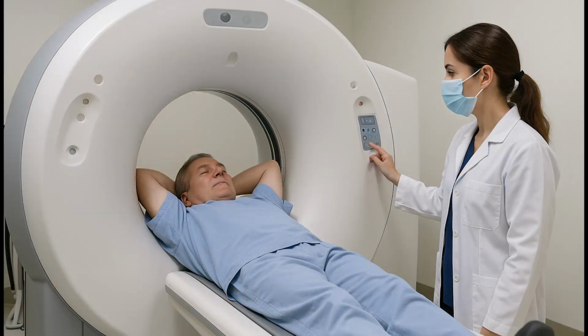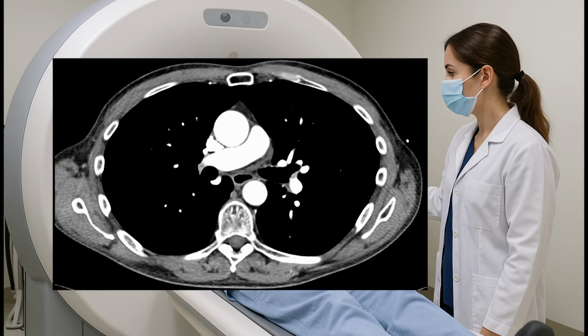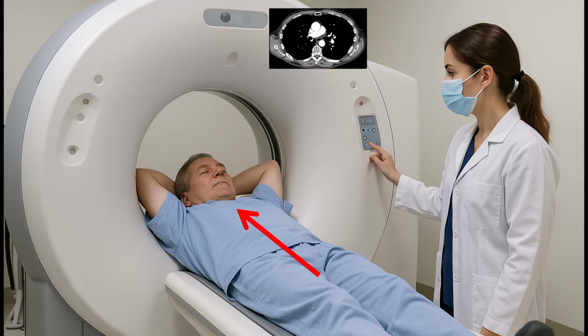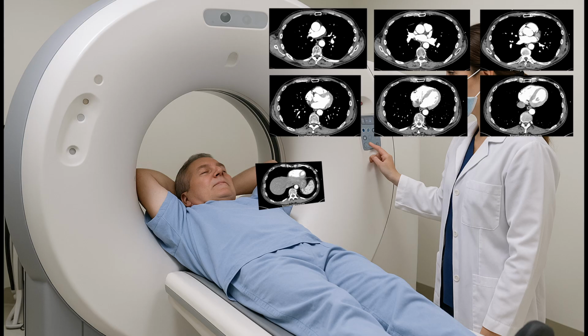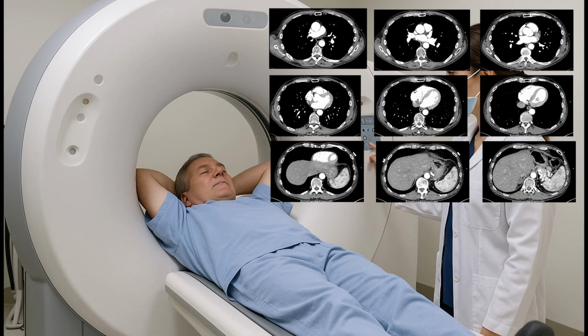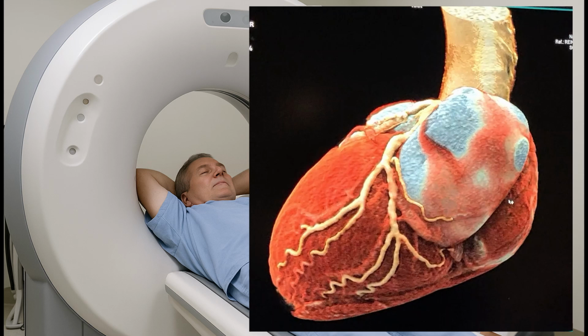Coronary CT scans use a big donut-shaped machine to rotate a narrow X-ray beam around you. The computer gathers the results of that and creates a 2D image of a single slice through your body. The table then moves your body down a bit and repeats the process over and over again, so you now have multiple images of slices of your body. The radiologist evaluating those images and creating that report has special software that uses those 2D images to construct a full 3D image of your heart.